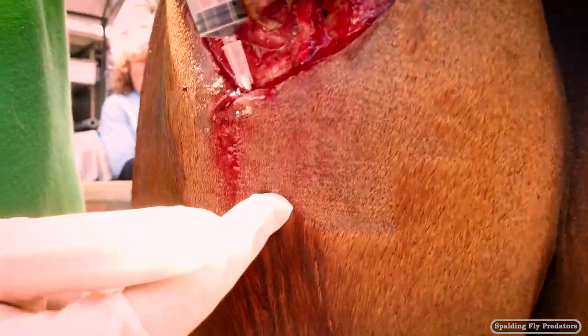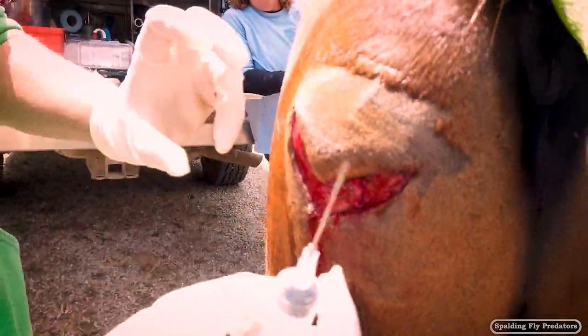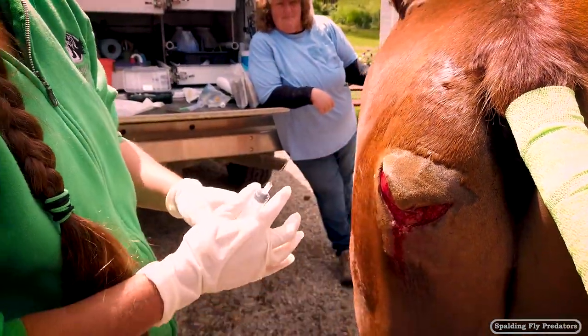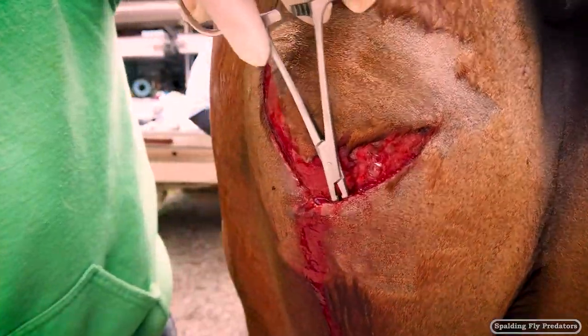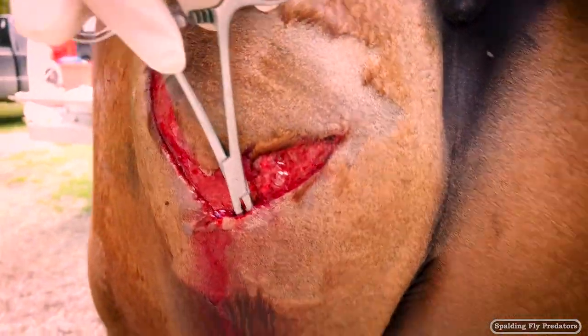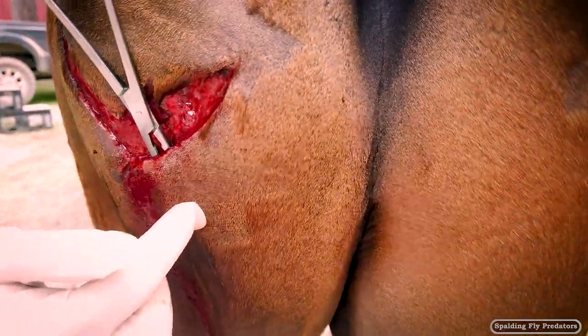You can see it bubbling up under the skin right here, and that's where we're going to put that drain. The drain is going to attach up here and come out down here. We're going to put that in first and then put in the buttons. This is undermining the skin right here, and then we're going to put a little stab wound — that's going to be the bottom of where our drain is going to be.